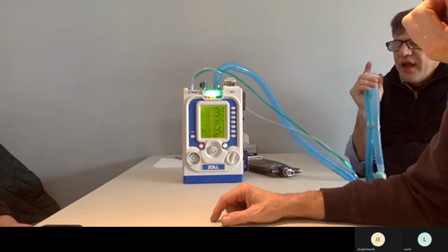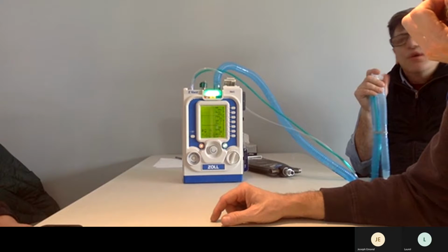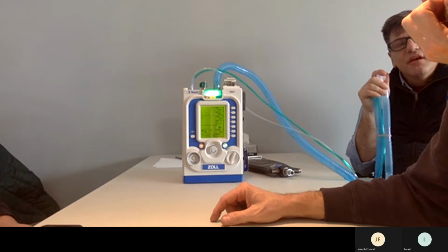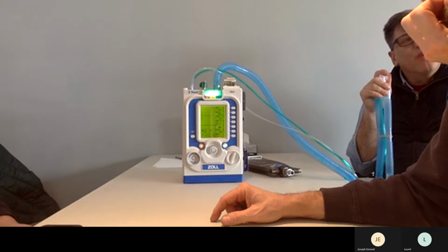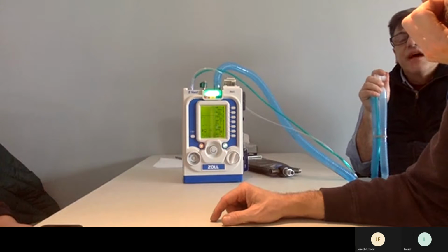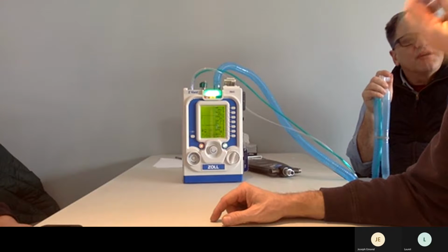So the Hamiltons or the LTVs have a leak compensation of 2. The Newport HD70s have a compensation of 3. This one has a compensation of 30 liters per minute, so it easily overcomes that little hole. To be fair, some of the ICU vents have leak compensations as high as 100, so some of them will outstretch that.